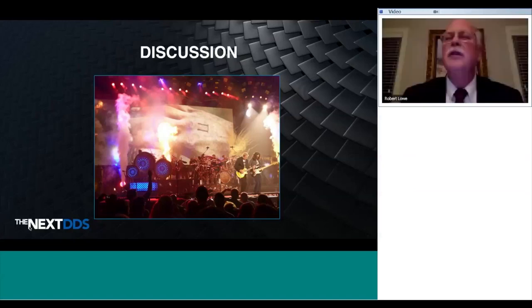That's a great question, because there's still a little bit of controversy on whether you can prepare zirconia like gold or whether you should prepare it like porcelain. So the answer would be yes. The bigger question is this. Most teeth, at least in my experience, that I prepare for zirconia are not virgin teeth. Most of those teeth have had existing restorations. What is the number one thing that determines what your margin will be? The number one thing is what was there to begin with. If there was already a big wide shoulder, guess what? You can't make it smaller. It is what it is.